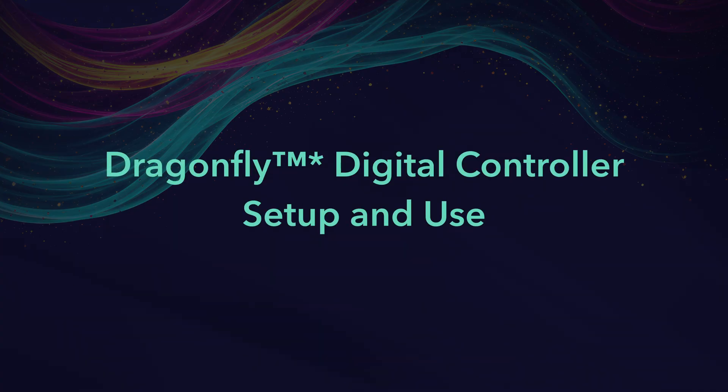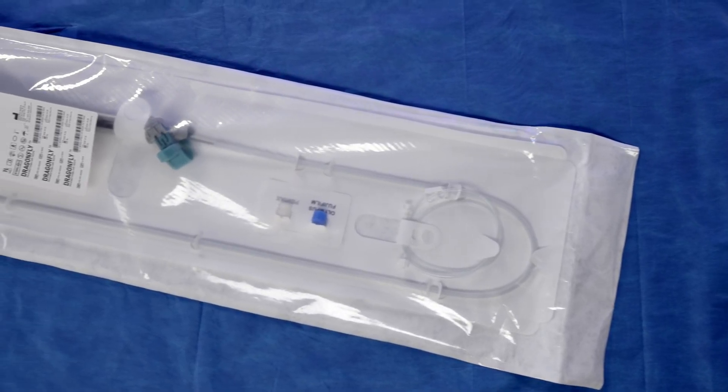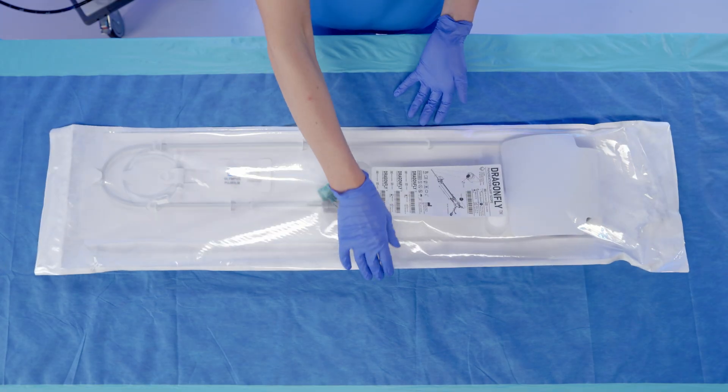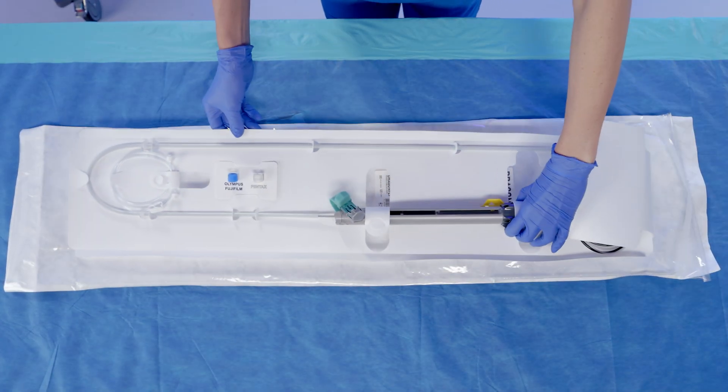Dragonfly Digital Controller Setup and Use. Inspection and Preparation. Inspect the packaging for any damage and do not use if compromised. Ensure the device is sterile and within its expiration date. Before use, check all components for damage.